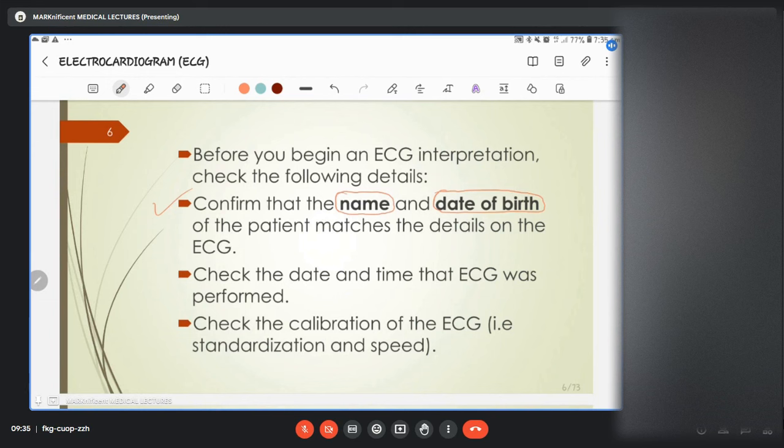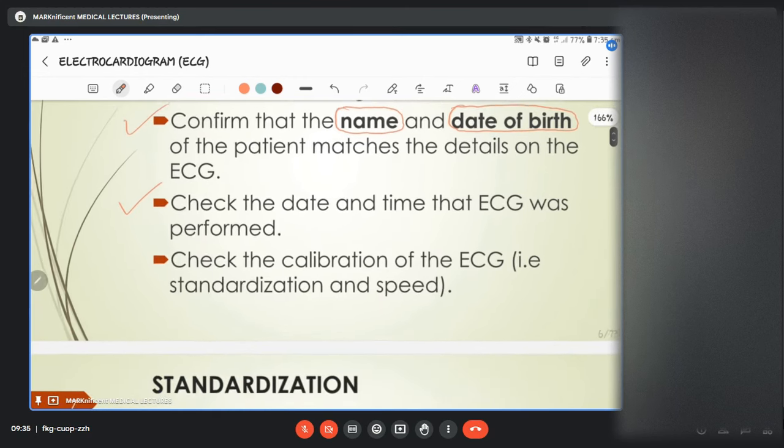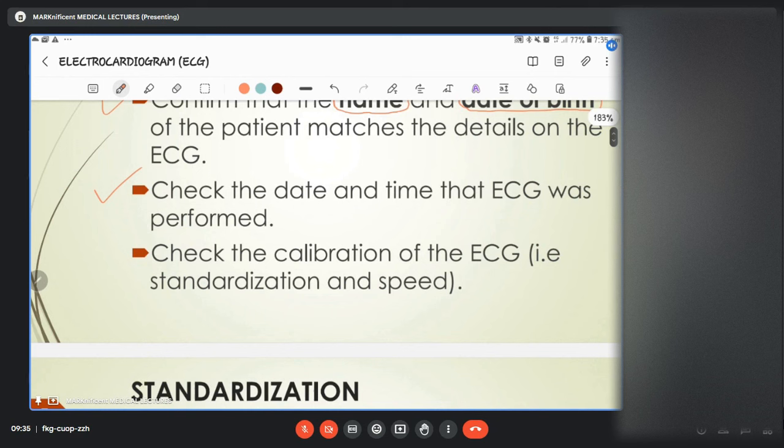If the patient has come with complaints, you try to establish when the condition started. If the ECG was taken a long time before, maybe as a referral to your hospital, and this is a recent condition, you might want to take another ECG. If it's most recent, or was taken after the presenting complaints, then there's no need.